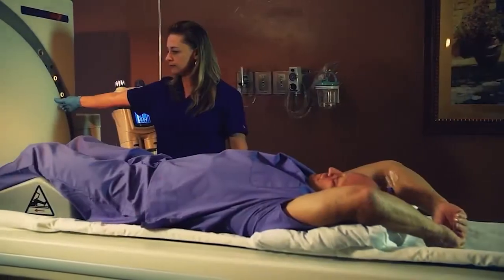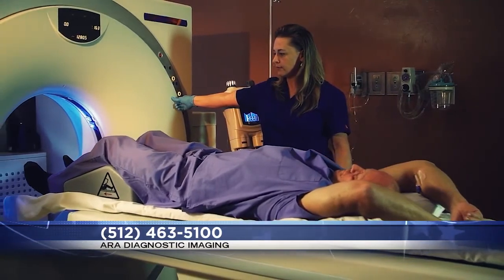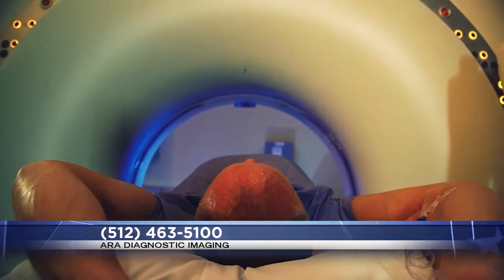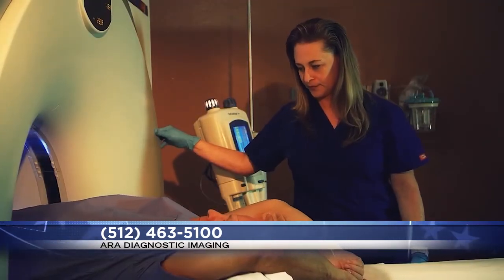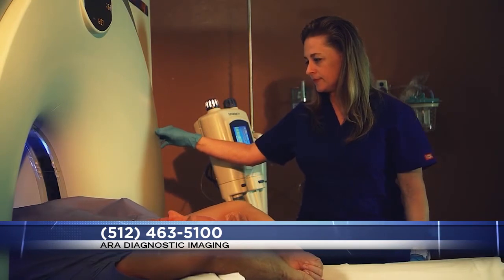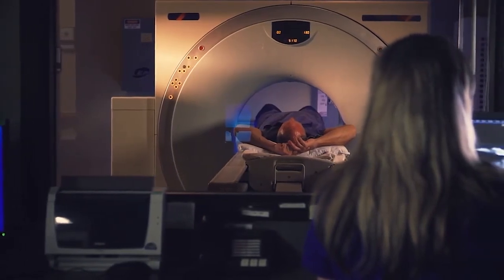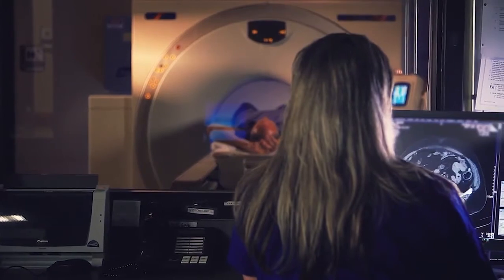Yeah, most people check in just like any other exam that you would have. And we usually will get vitals, so blood pressure, that sort of thing. If you need to get contrast, you can actually get it in your vein. So we can do what's called intravenous. You'll meet with the CT tech, they'll take you back to the suite. You'll see this big machine that kind of has a big white donut with a table that rolls through it. Sit down, they'll leave the room and instruct you over the microphone.